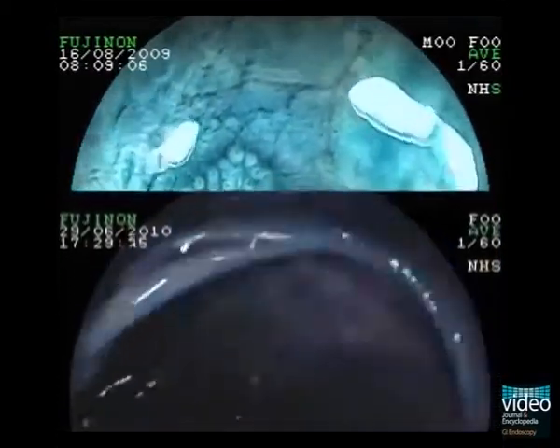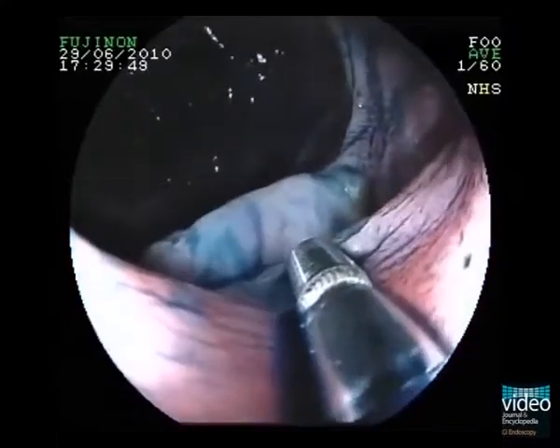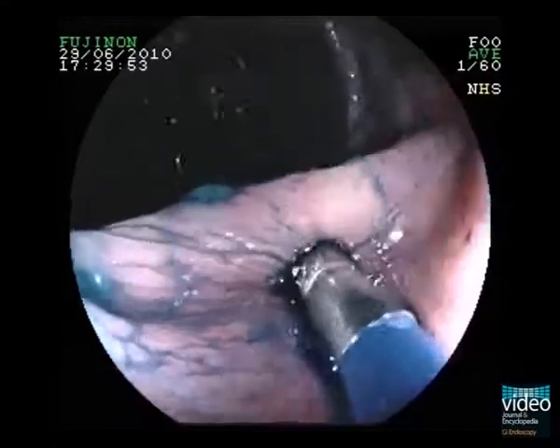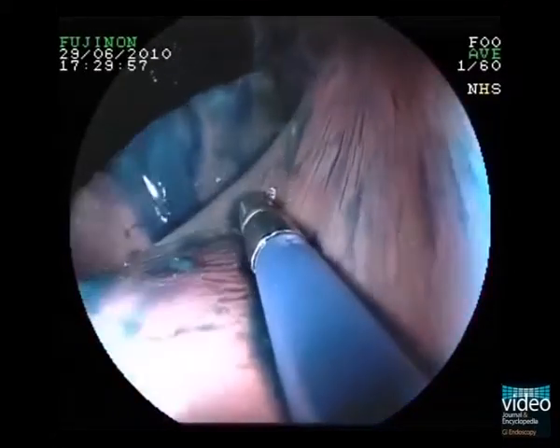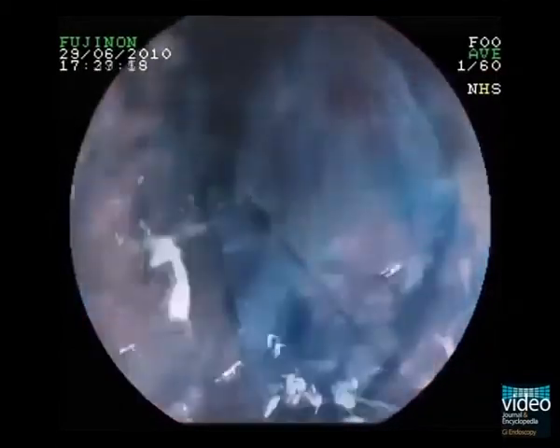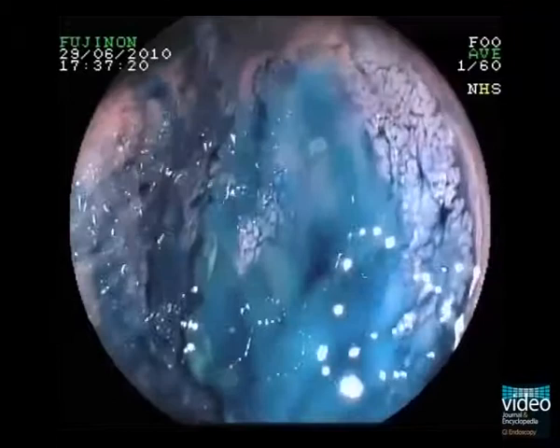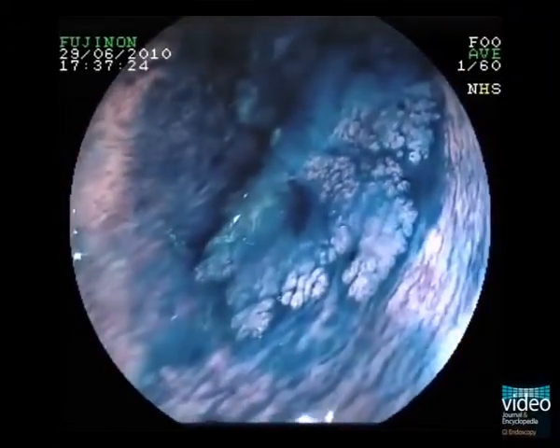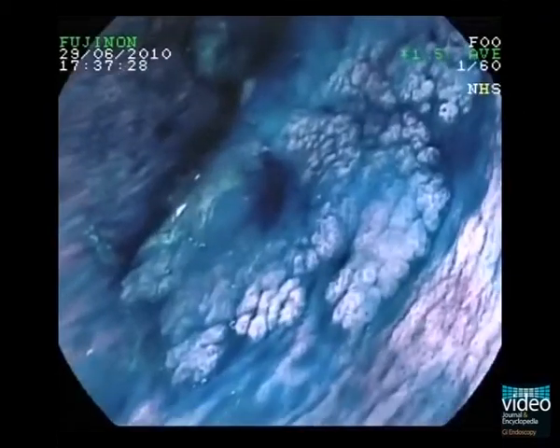This is the third case presented here. During dye spraying, we use the catheter to straighten mucosal folds for inspection of the proximal side. Here we see this large flat lesion that appears as a thickened fold. You can appreciate all characteristic features of a serrated adenoma: mucus covering, kudotype 2 pit pattern with typical stellate crypt orifices, and a flat phenotype.